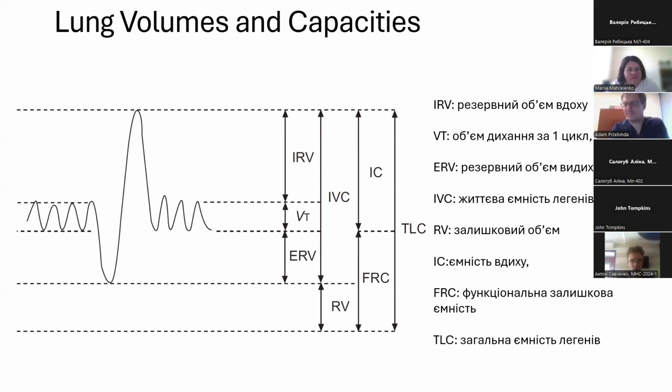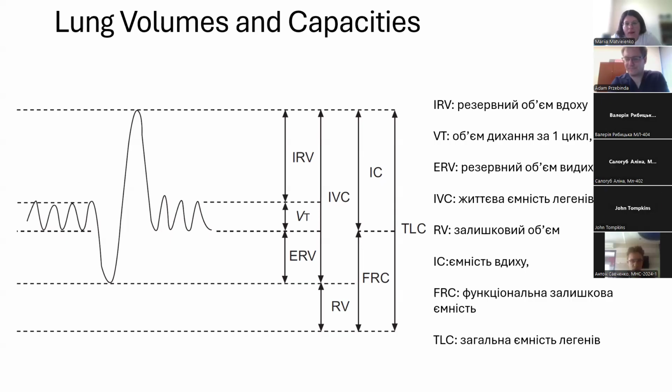Yeah, Valeria, please. I want to ask about contraindications for plethysmography. There's not too many. The main contraindications to pulmonary function testing are if you've had a recent pneumothorax. If you have a hole in your lung, you shouldn't be doing these maneuvers where you're taking deep breaths and exhaling. The plethysmography part, though, all you're doing is kind of panting. So safety-wise, there's not a lot of concerns.